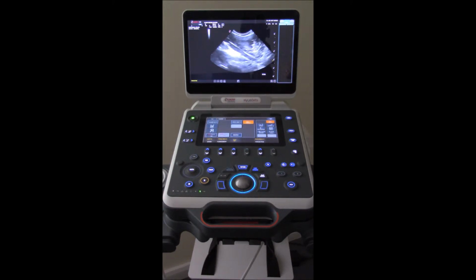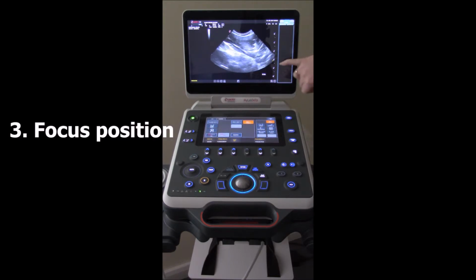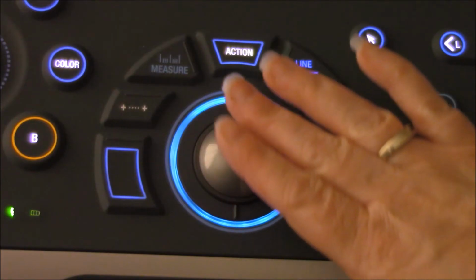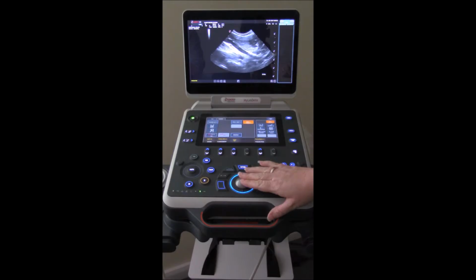The next bit we're going to adjust is the focal zone. So you can see we've got this little yellow dot here, and we can move that up and down just by rolling the roller ball up. You want this dot in line with your area of interest, because that's where you're going to get your clearest image.